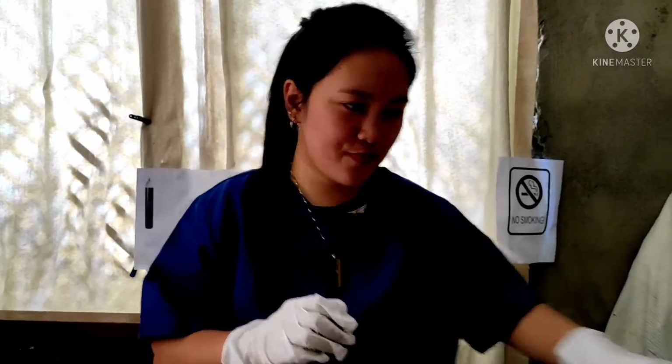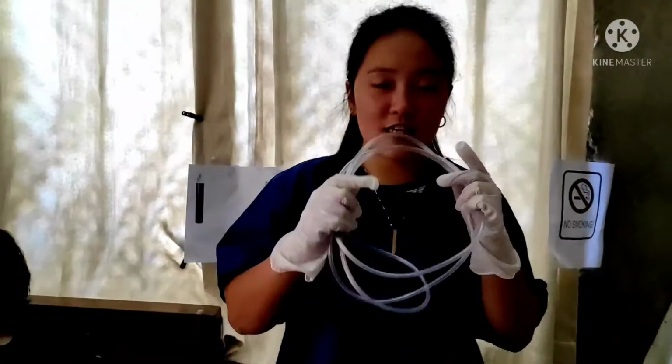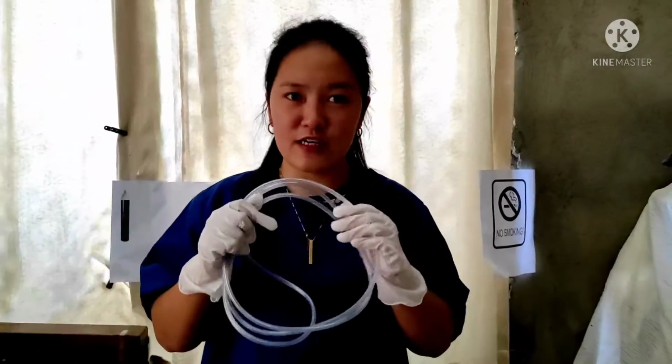Blow out dust from the oxygen cylinder to prevent dust from entering through the exit of the cylinder to the nostril. Attach the cannula with the connecting tube to the adapter on the humidifier. Let's assume that this is a nasal cannula.